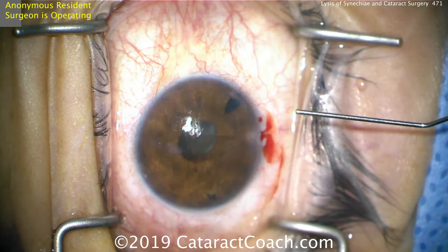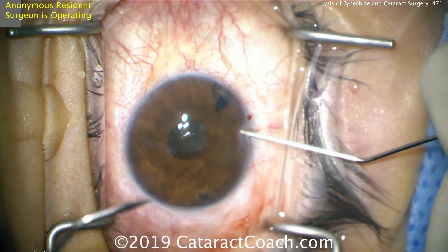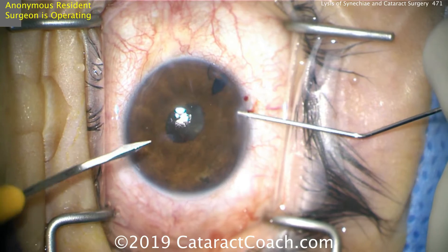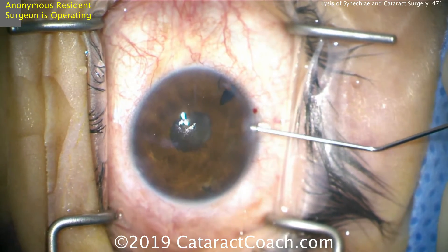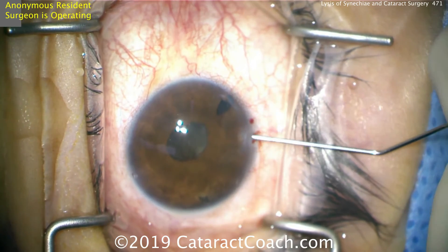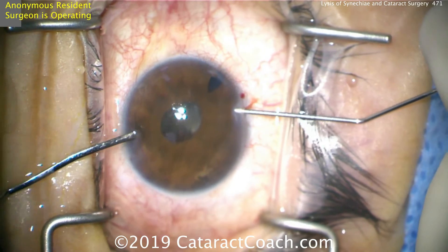You want to be very gentle in doing this, and we're doing this just with balanced salt solution in the anterior chamber. Refill the chamber with a second paracentesis and do the opposite 180 degrees. This will free the iris adhesions from the anterior lens capsule. This is not a very difficult thing to do.